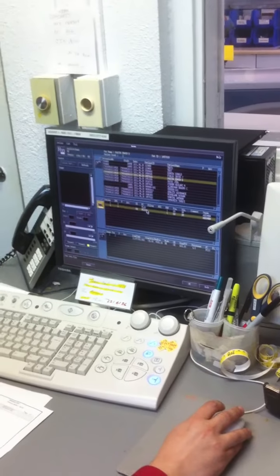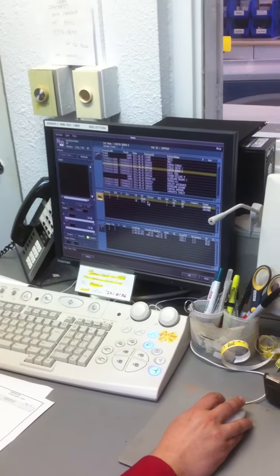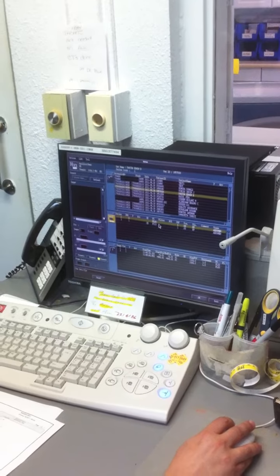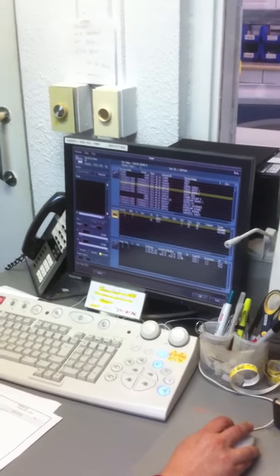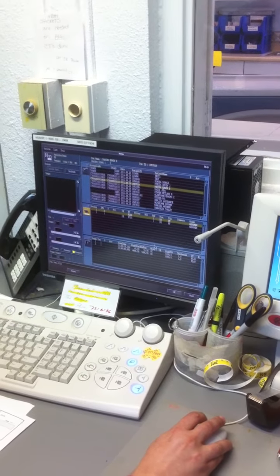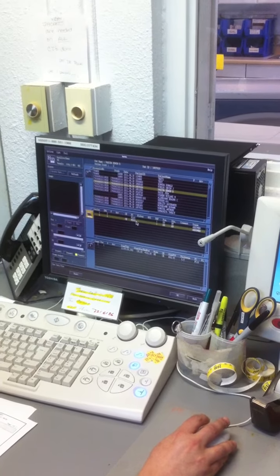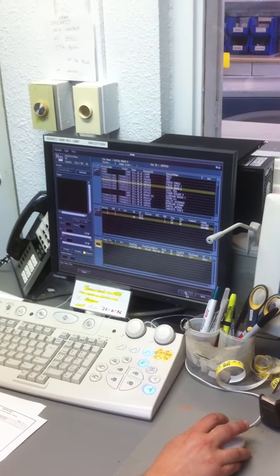I was thinking loaf and not cut. It's a loaf of bread, not a cut slice. And then your mode here says SC for Scano. When I click on it here, the mode, see that? 273. And I want this helical. So you must be specific.